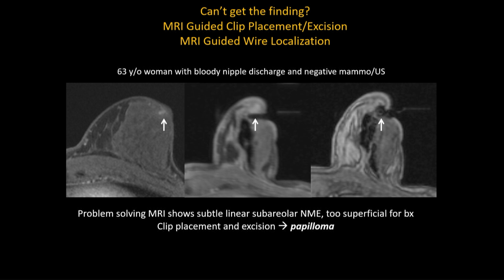This was too superficial and too difficult because her nipple areolar complex is actually over here. The nipple is not in profile. So it's too superficial for a biopsy, even with a petite needle. So what we did is we placed a clip.